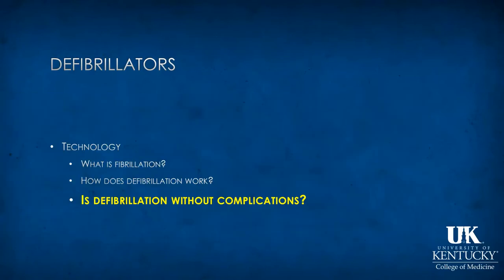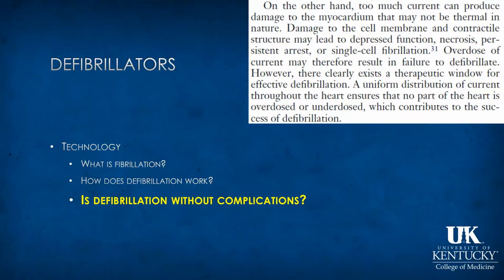So is defibrillation without complications? Well, nothing's without complications. So just extracting this paragraph sums up the fact that too much current can cause damage to the myocardium, which may not be thermal in nature. Cell membranes and contractile structure could be damaged, leading to depressed function, necrosis. Overdose of current may result in failure to defibrillate. However, there is clearly a therapeutic window for effective defibrillation.